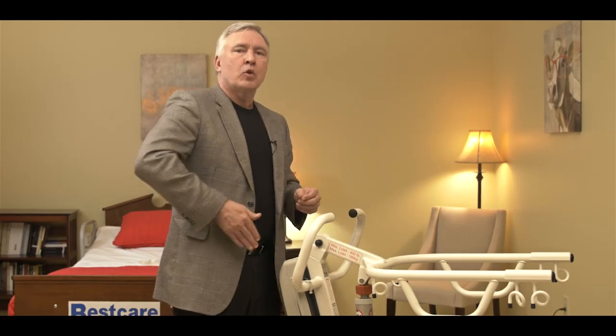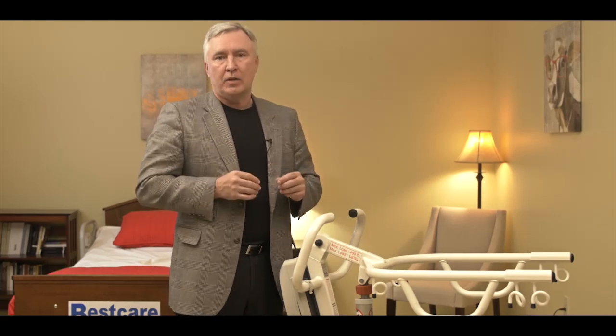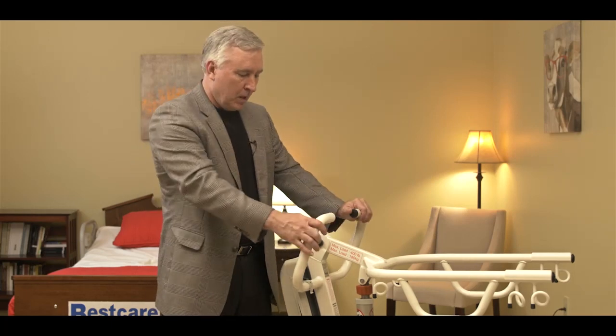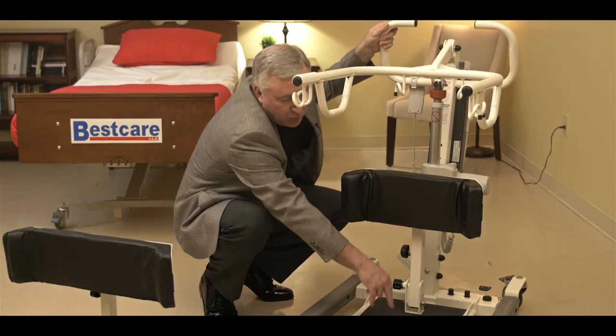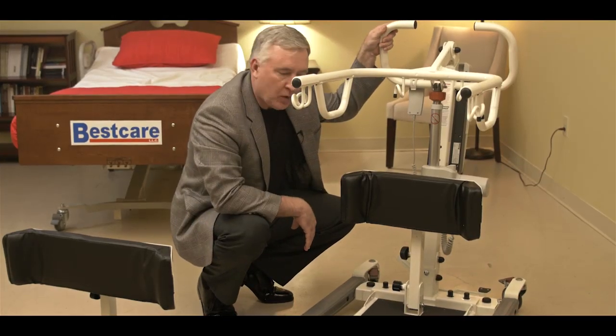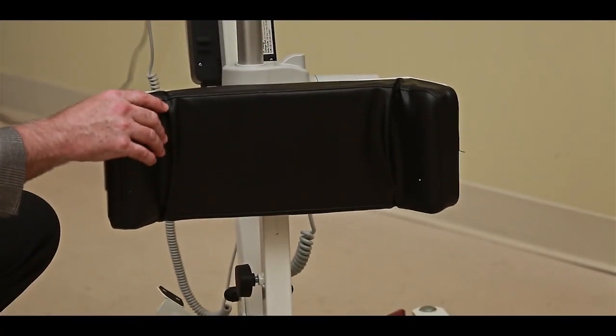You'd lock it to raise the patient up, and leave it unlocked when you're lowering the patient back down into the sitting position. You can see from the bottom of the lift that we have a foot plate located here — that's where the patient's feet are going to rest when we make the transfer — and a knee brace that's going to brace the person's knees during the transfer.